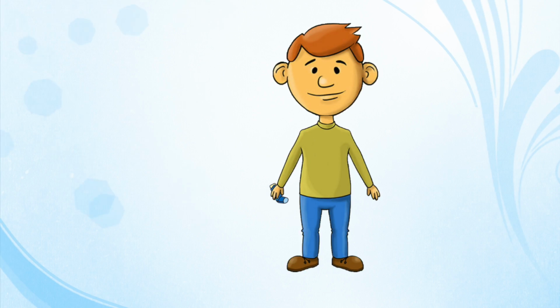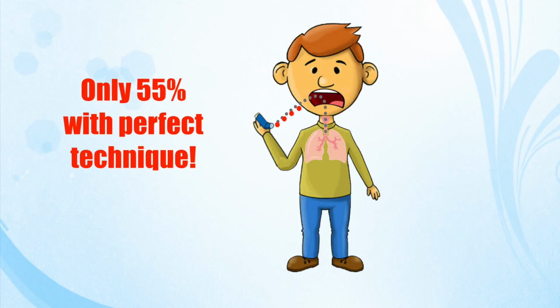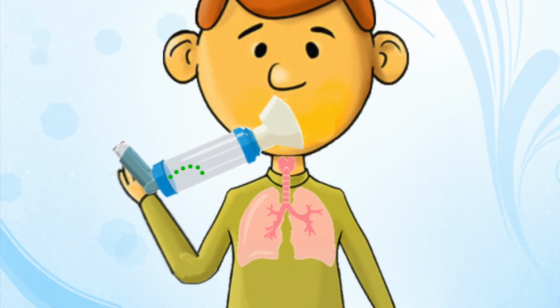When using an MDI alone, only 55 to 60% of the medication has been shown to reach the respiratory tract, because a large amount directly impacts the posterior oropharynx. This is why spacers are recommended, as they hold the aerosolized spray, slowing its velocity, so that it can be better delivered to the lungs.